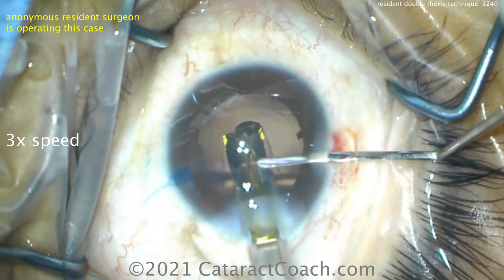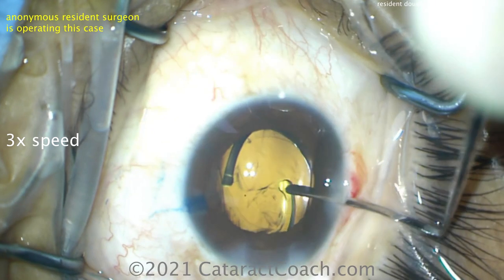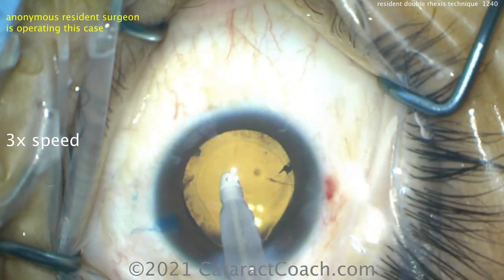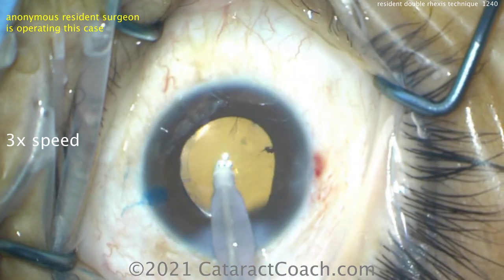Here comes the lens going in the eye. A single piece acrylic lens will get delivered nicely into that capsular bag. And now we can see what size the rexus was because we know that's a six millimeter optic. Actually, look at the dilation — it looks like the dilation is slightly under six millimeters. Maybe that rexus is just about five. So very nicely done.